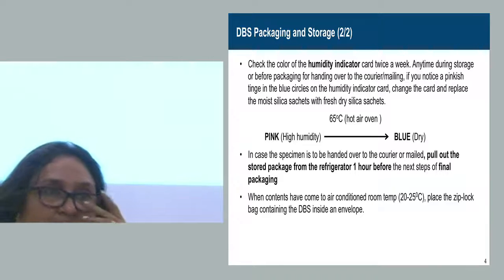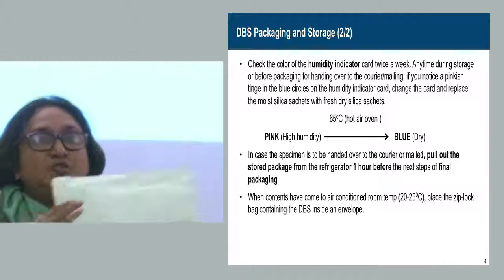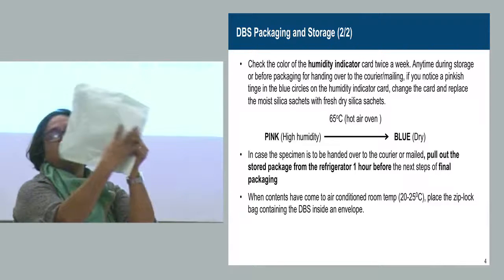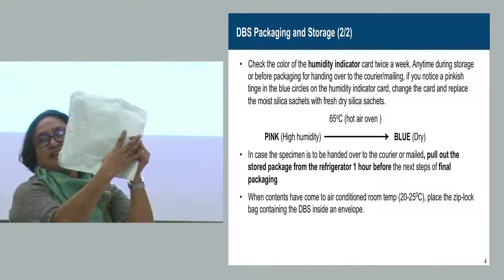Because of the regulations for transport of biohazardous material, you need to put a biohazard sticker on top of the outer envelope. The address of the laboratory should be written very, very clearly.